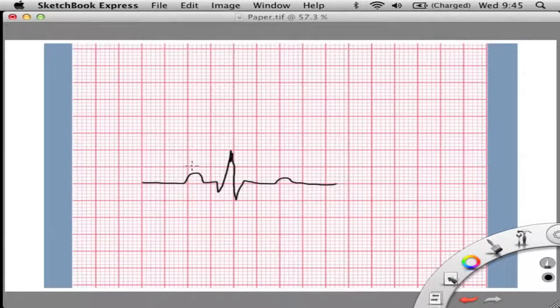Okay. So what would this be? P wave, okay. What about this thing? Q, okay. R. What's this over here? Okay, good. See, I got to mix it up so you don't just follow the alphabet. You all know the alphabet. Okay. What's this? Okay. What are we missing? J point. Okay, where's the J point? Is it here? Right where the S comes back to the isoelectric line. So right, yeah, okay, all right. Okay, I cannot draw a straight line on paper, let alone on a tablet. Give me a break here. Okay, so we'll say that this actually looks like this. We'll call this the J point. Okay.